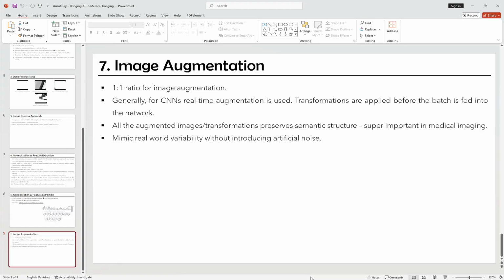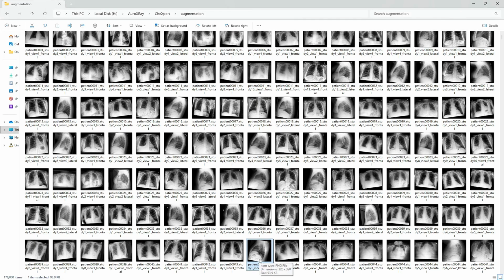In this project, since I'm extracting the features beforehand and then training the model, the static 1:1 augmentation strategy was used. It does simulate real-world variability effectively and enhances the model accuracy. It provides the necessary variability in the image representation, obviously without adding any computational overhead during training, because the features are extracted beforehand and our final ARFF file has both the training features and the augmented features.